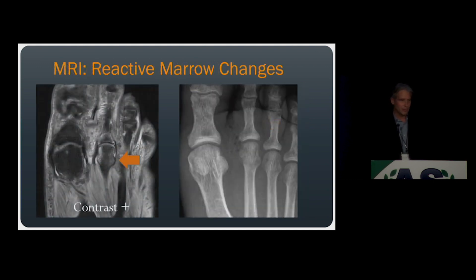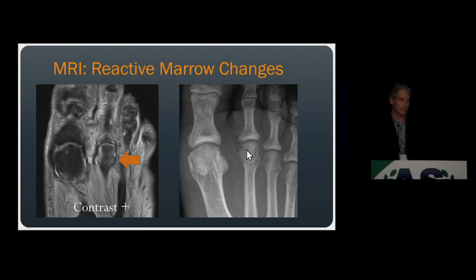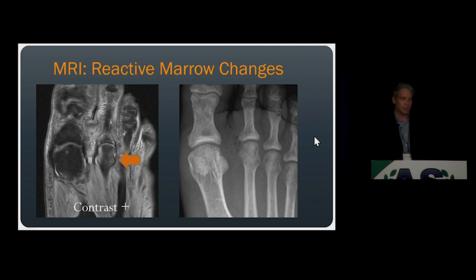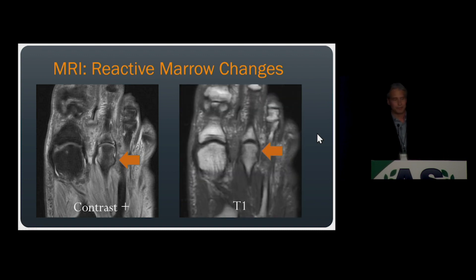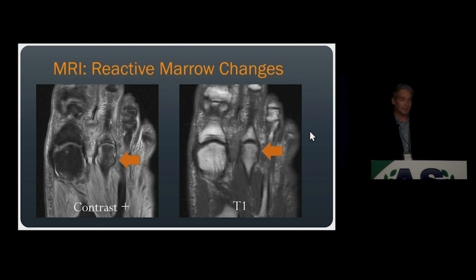Let's compare this with another patient presenting with concern for osteomyelitis. They have an ulcer in their forefoot and soft tissue gas adjacent to the second metatarsal head, but no findings of osteomyelitis on radiograph. On MRI, there is prominent enhancement within the second metatarsal head. Is this osteomyelitis? You should look at your T1 sequence. On the pre-contrast, non-fat-suppressed T1, while there is a little diminished signal in the second metatarsal head, we're not seeing complete or confluent replacement of the T1 fat signal. This is what we call reactive marrow changes.